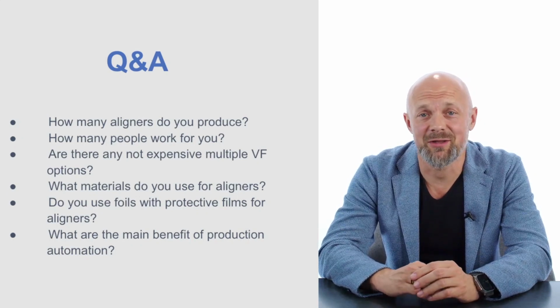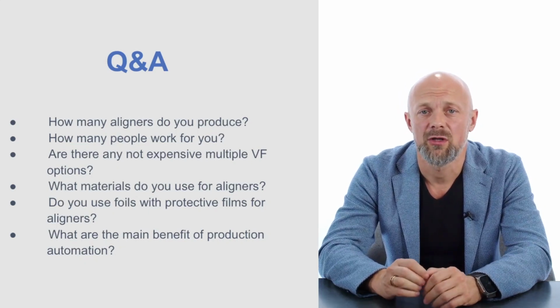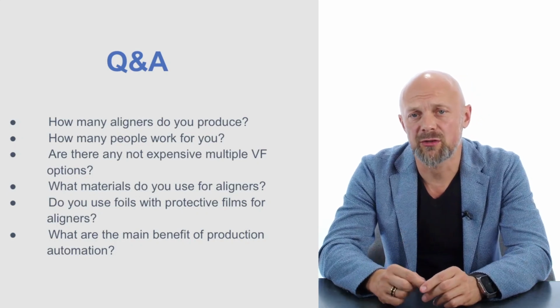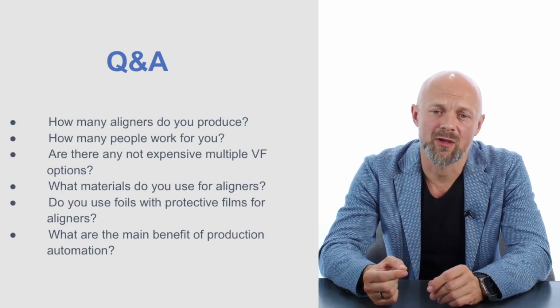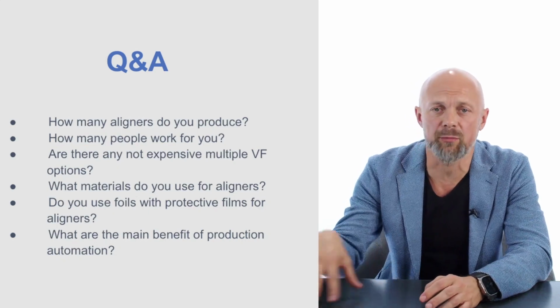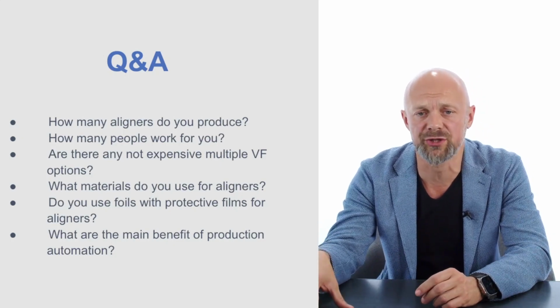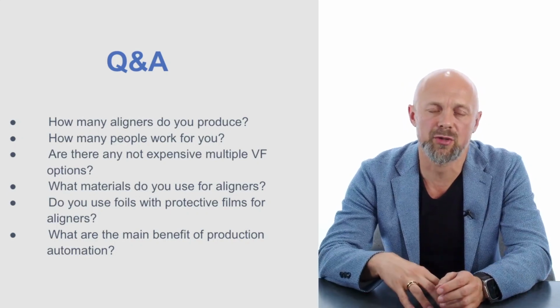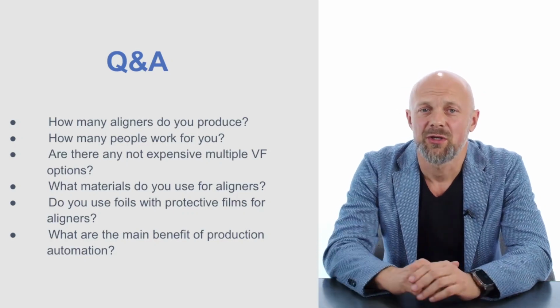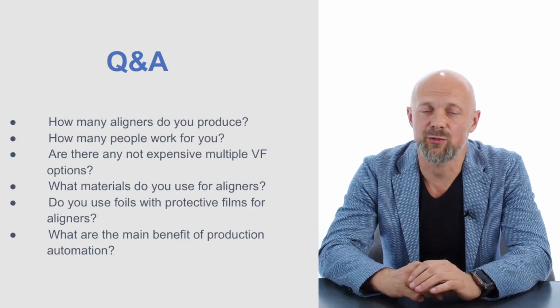But let's say in our case it also doesn't work. We used this device for around 4 months, and after 4 months we saw a lot of small technical problems for some part of the working platform. The device cannot produce enough pump, enough pressure. Another part of the working tables is not hot enough. So after 4 months of different experiments, we stopped using this device. So it also doesn't work in massive production.